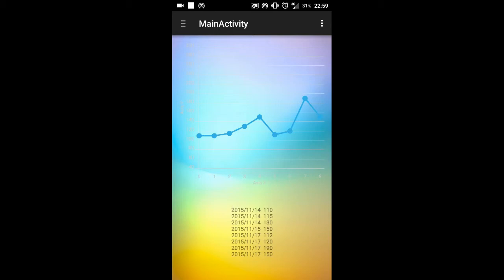When we push over the user as a follower, we retrieve all this information from the remote server. And if we push over the information in the local phone, for example as user, we retrieve this information from the SQLite database.